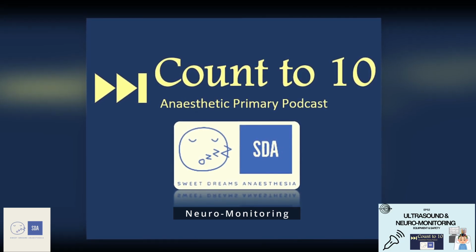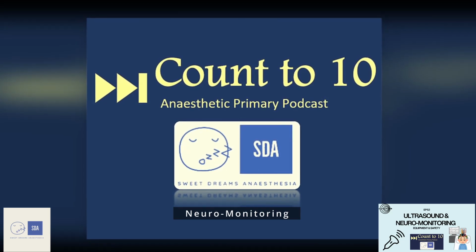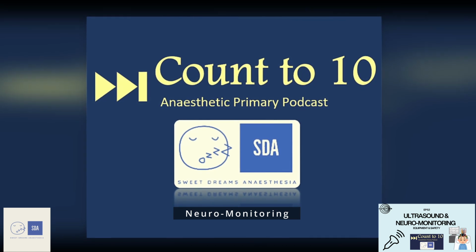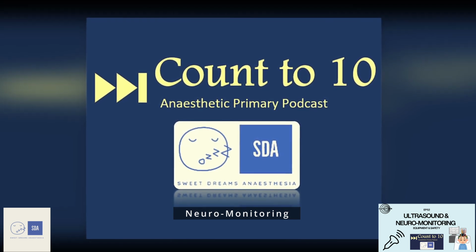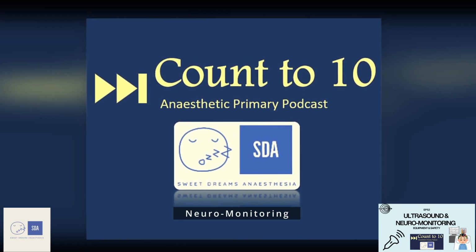While on BIS, we get a single EEG trace, which is a processed EEG made with Fourier transformation and multiple time domain analyses, alongside a dimensionless number from 0 to 100 with some secondary outputs such as EMG, signal quality index, and spectral edge frequency.